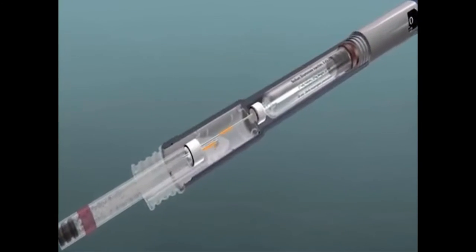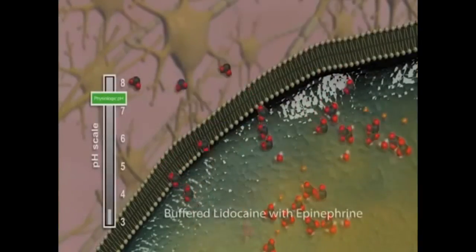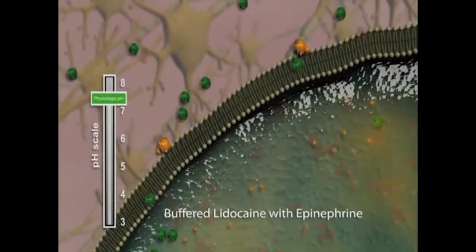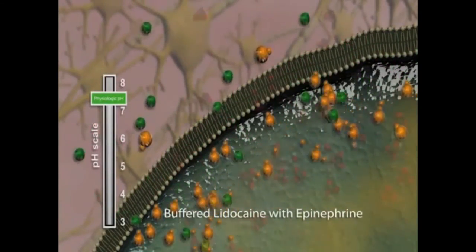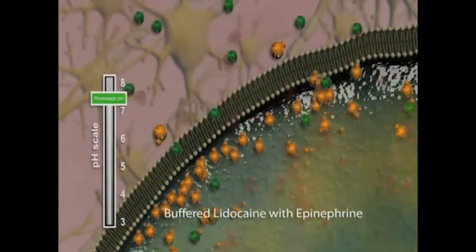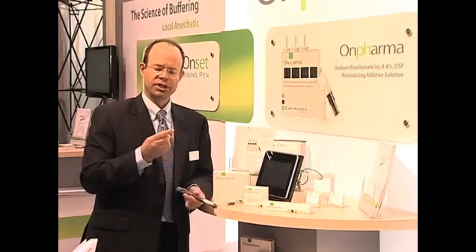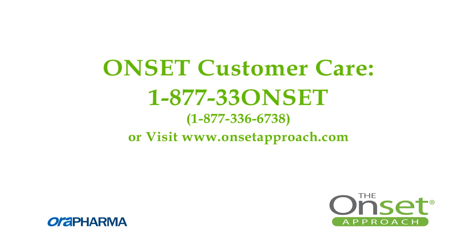By pushing the button, I just took that cartridge from a pH of 3.5 up to physiologic pH. That allows us to have 6,000 times more of the base form of the anesthetic — the active form — which is lipid soluble and will go through the nerve membrane just like that. We then take the cartridge connector back to position one, remove the cartridge, and drop it into your dental syringe or however you'd like to deploy it. For more information, call our customer care at 1-877-33-ONSET.